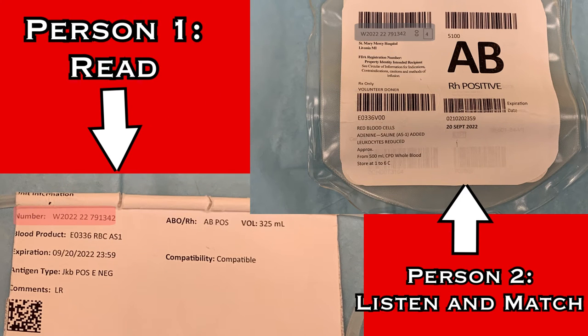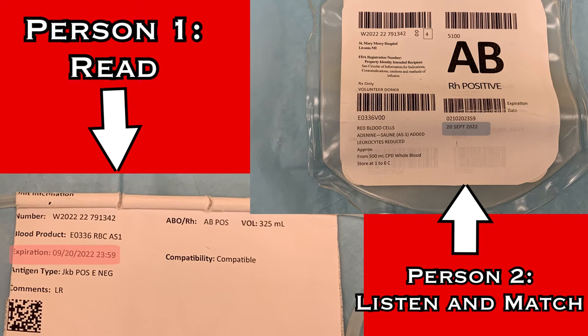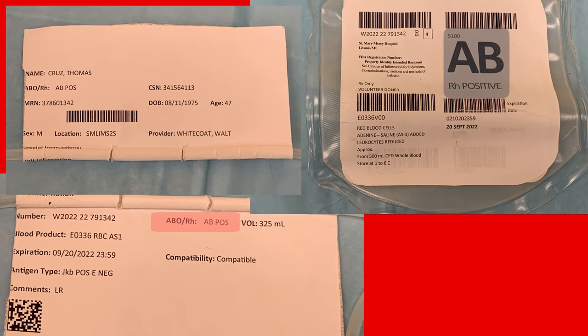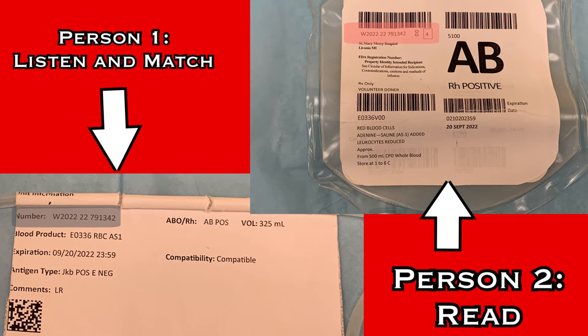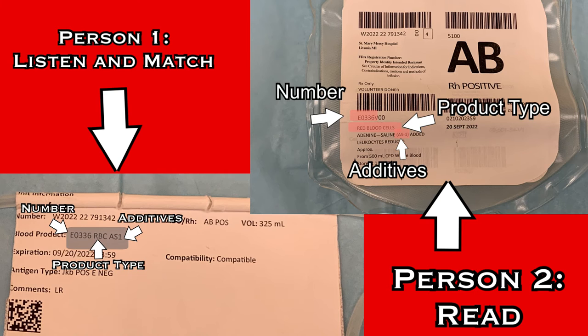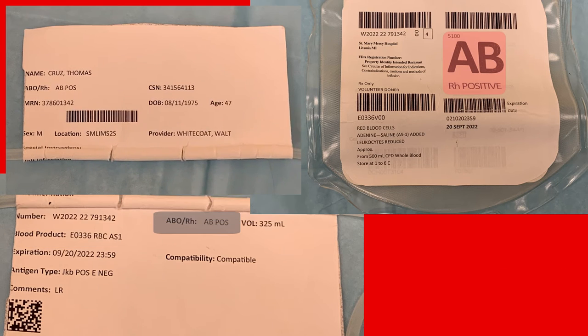Read the unit number, the blood product code, the expiration date, and finally the blood type. Check that the patient's blood type on the opposite side of the sticker matches to ensure that they are compatible. Then reverse the process and have the information read back — unit number, blood product code, expiration date, blood type, and confirm the patient's blood type also matches.